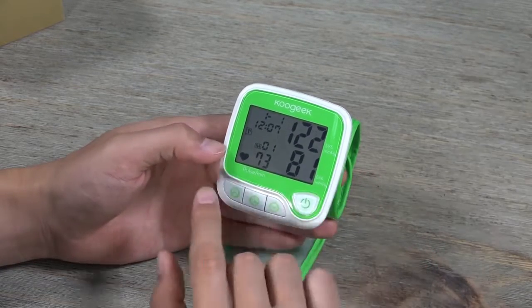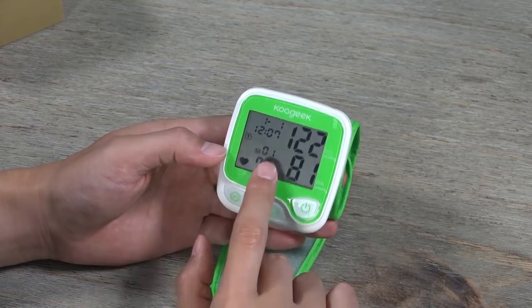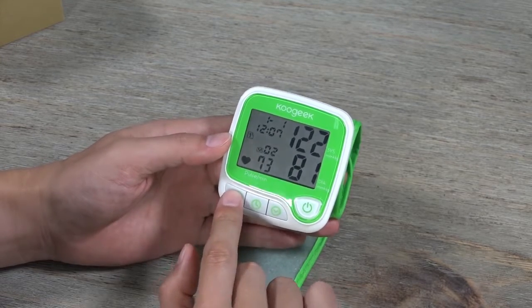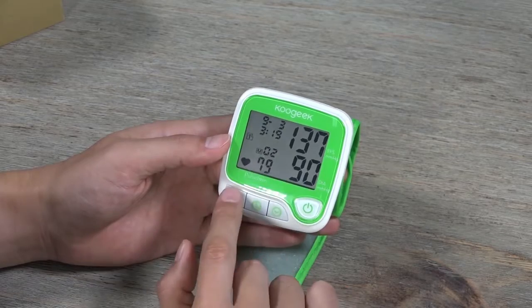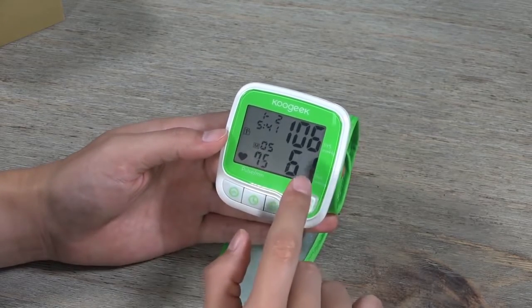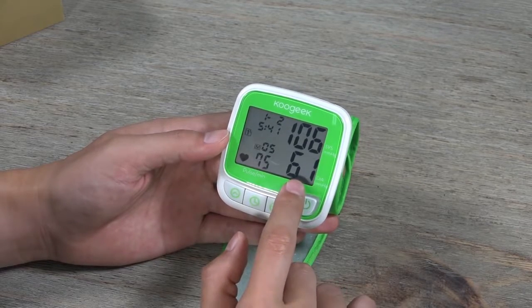When you press it once, you can see your previous records. This is the last one — pressing it again shows more records. It's actually able to record 99 records.